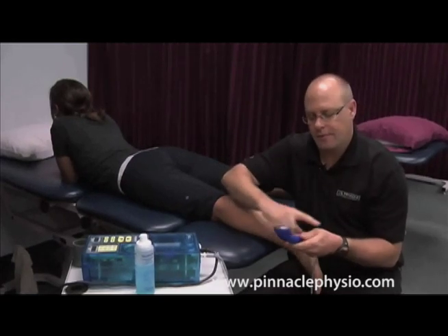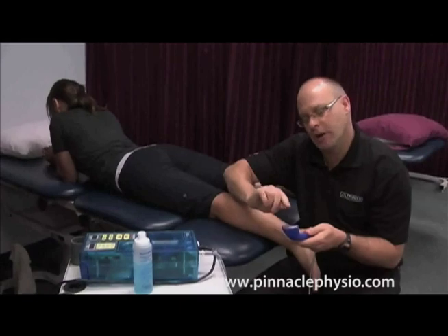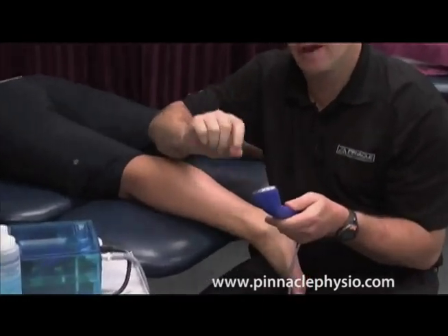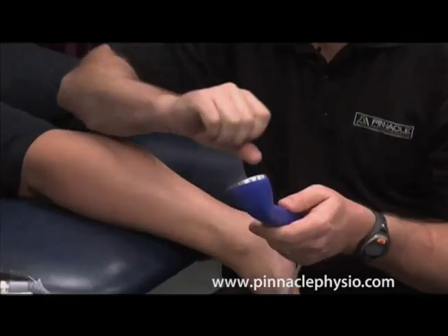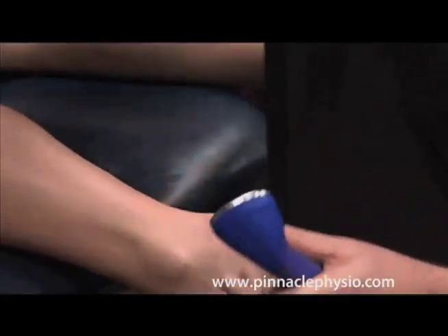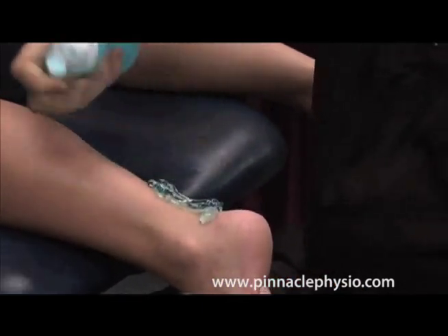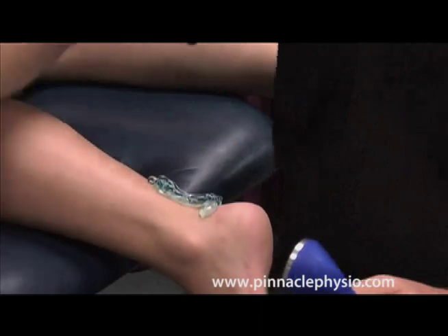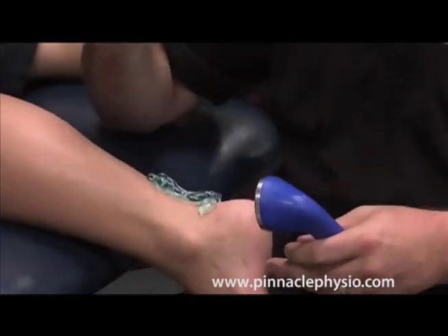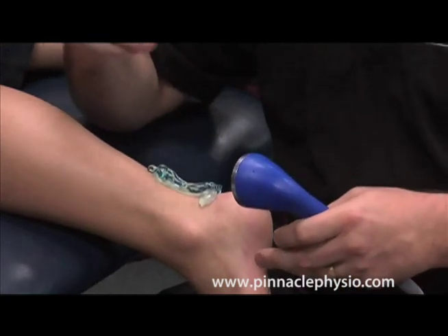With ultrasound, there's a little crystal inside the sound head and we run an electric current through the crystal, which vibrates at a certain frequency. That vibration creates sound waves. We then use gel — here on an Achilles tendon for example — and the gel gets the sound waves transmitted through the skin into the area you're trying to treat.